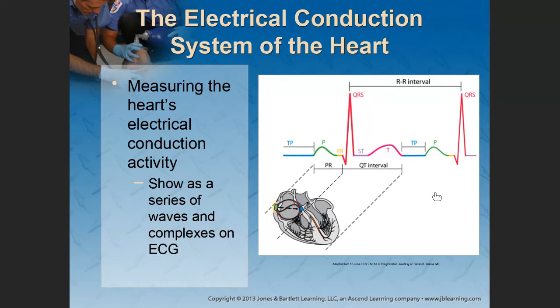So if you have a cardiac monitor, it can give you a ventilation rate, you can get a pulse rate, you can get pulse oximetry, capnography, and a blood pressure. It has an AED mode and a manual defibrillator mode. So the cardiac monitor can do more than just monitor the heart. It can monitor vital signs as well. But as it relates to cardiac monitoring, it is for a patient with a cardiac history and complications, or a patient with a respiratory problem, or any patient that you consider to be critical.